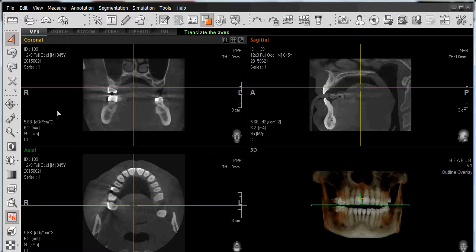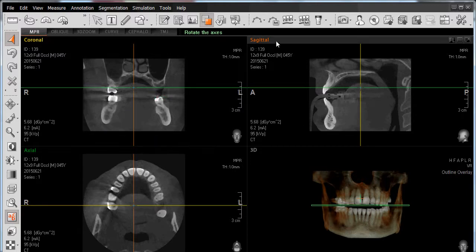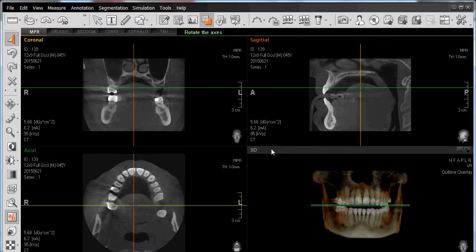Let's begin our navigation of the EZ3D software by starting with the Multiplanar Reconstruction, or MPR, view. This particular view is separated into four separate panes, identified in the upper left-hand corner such as coronal, axial, sagittal, as well as our 3D rendering.